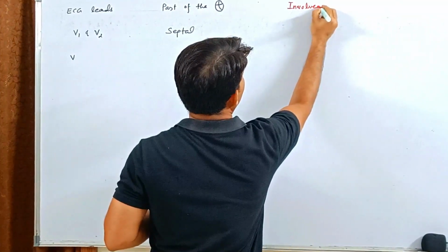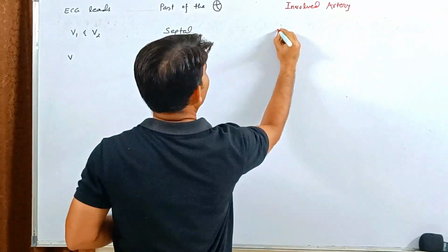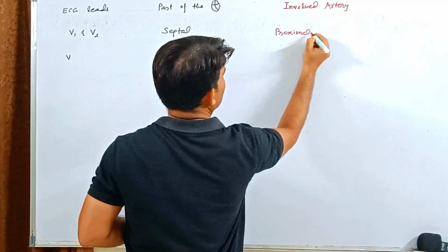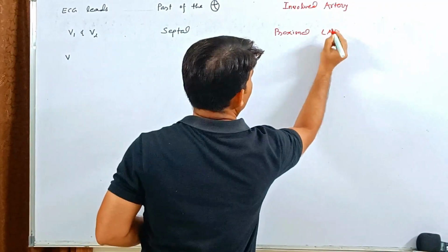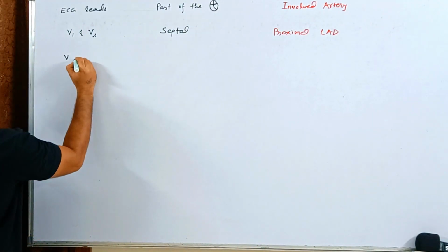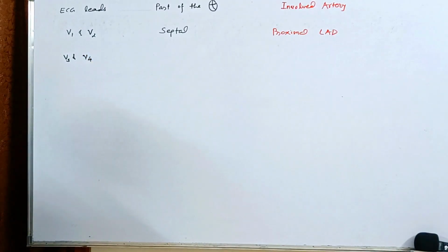The involved artery should be, yes, proximal LAD. Very good. Proximal LAD, right?